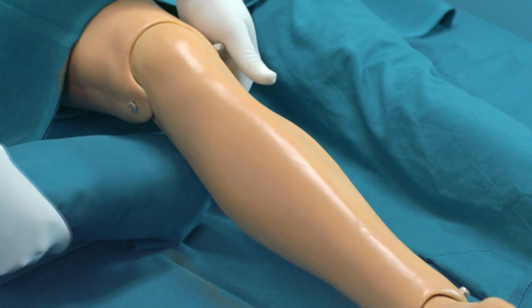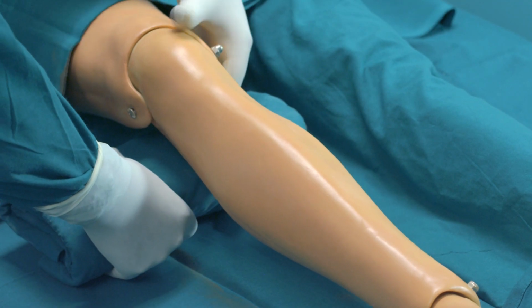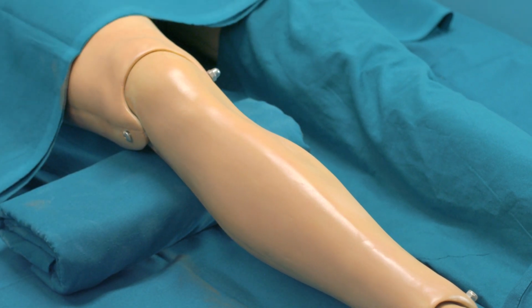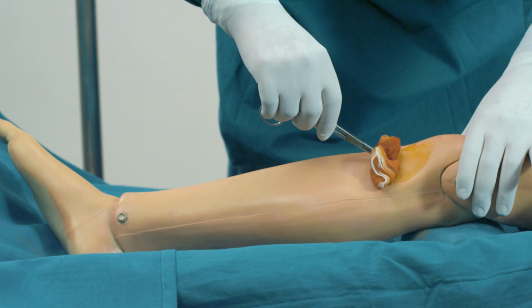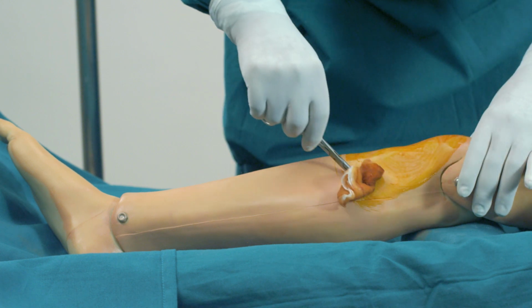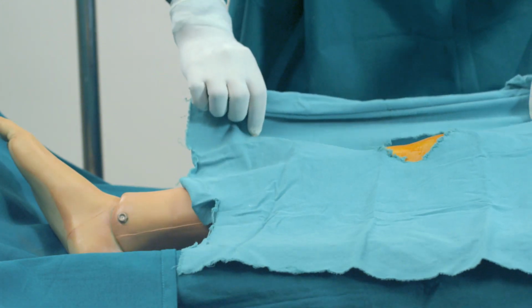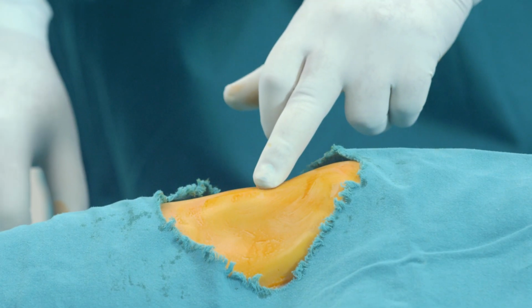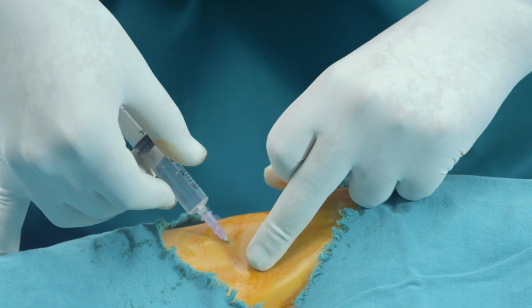The procedure starts with the positioning of the leg with the hold towel so there is slight flexion at the knee and external rotation at the level of the hip. Now sterilize the area with iodine solution and drape it. If the patient is conscious, then initially you will have to anesthetize the local area with 1% lidocaine.